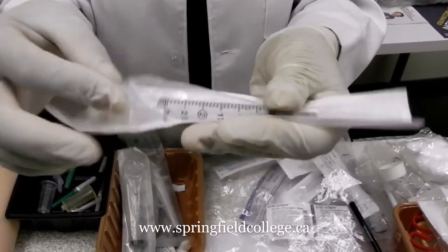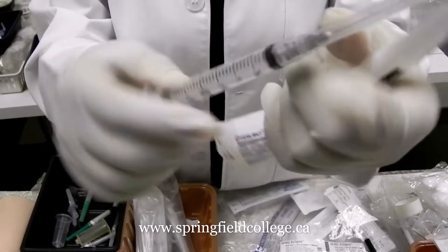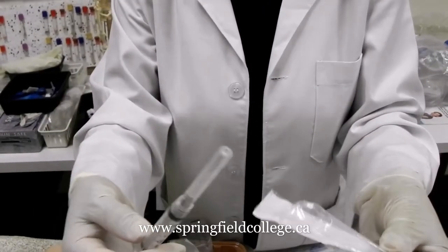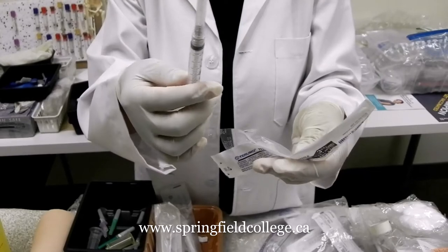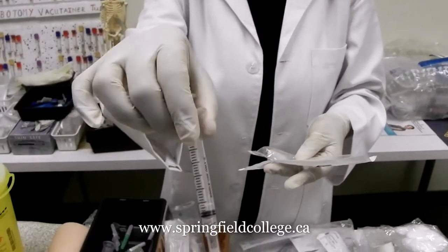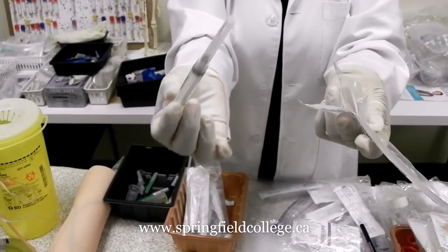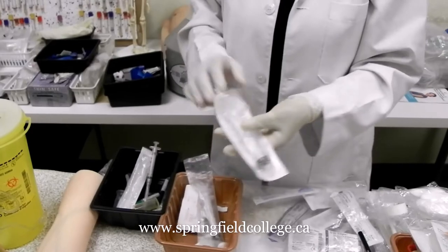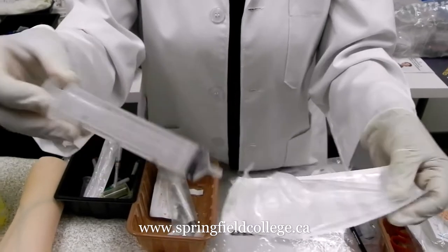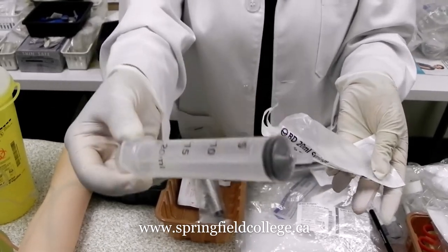Here you can see the commonly used syringe. How we use it I will show you in the next part. Different types and sizes of needles are also available. Generally for serum collection you might require 3 to 5 cc of blood. If we have to go for a larger collection, like for PRP, we might need a bigger size of syringe, but for general collections we may not require that much blood.